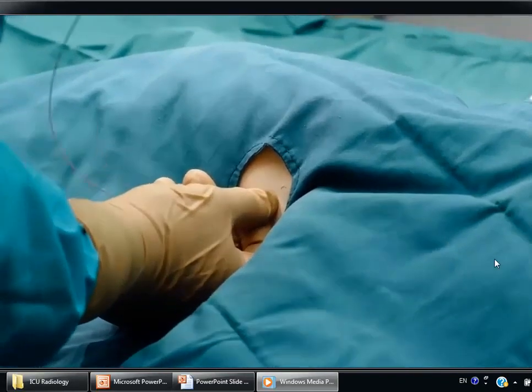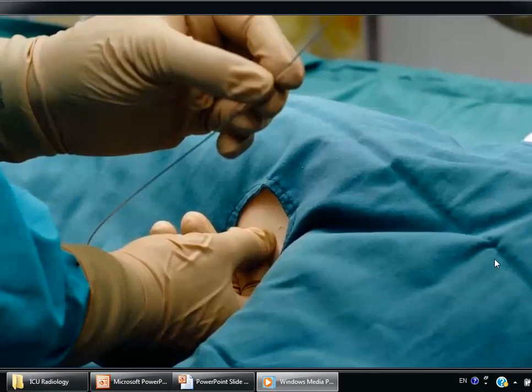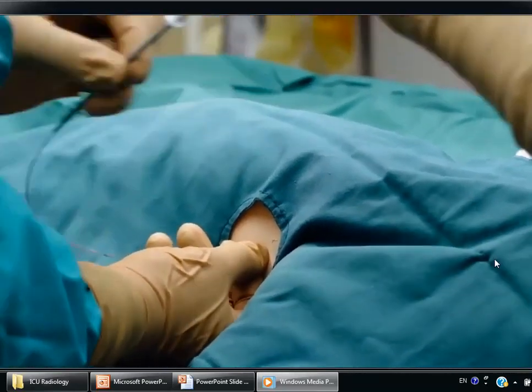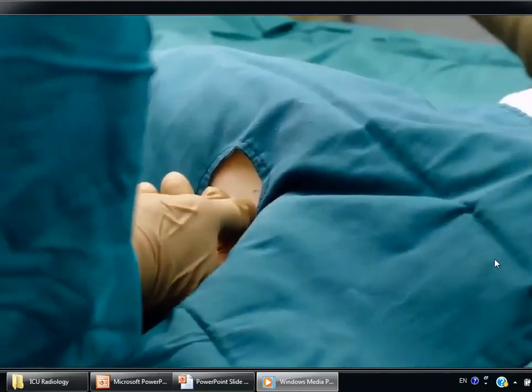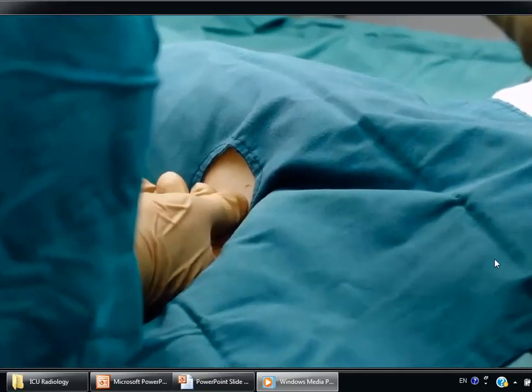Can you give me the dilator? Yeah, the smaller one. Pass the first dilator along the wire, through the skin about 1 centimeter, angling anteriorly, then remove the dilator. The skin may require a small incision. It is important that the wire is held still at all times and not advanced or withdrawn.